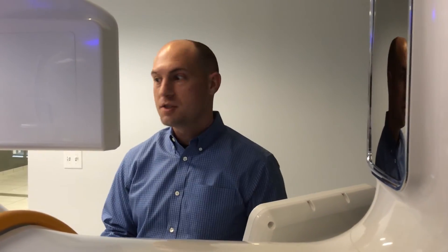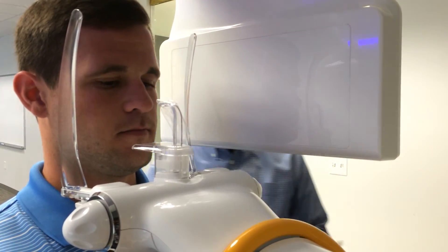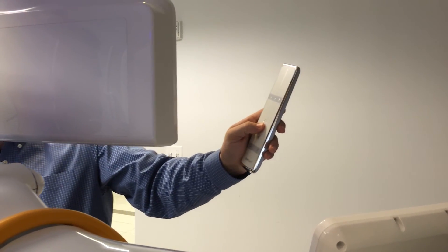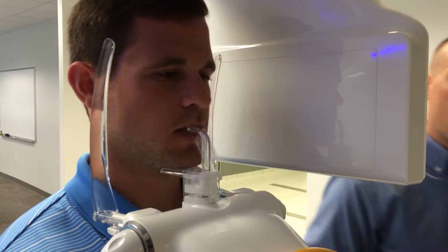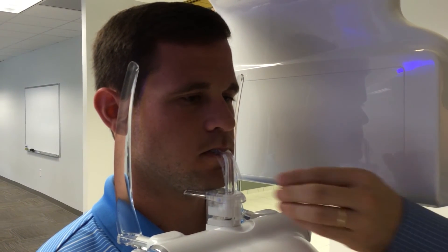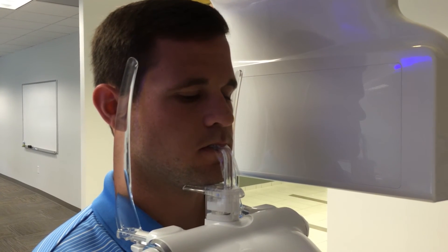JP is introduced as our patient for the panoramic acquisition. We have JP step forward into the machine and notice the chin rest is slightly too high, so the machine height is adjusted using the remote control. JP is instructed to step forward, place their chin on the chin rest, bite on the bite stick — feeling the notch for the front teeth — with the disposable bite sheath already in place.